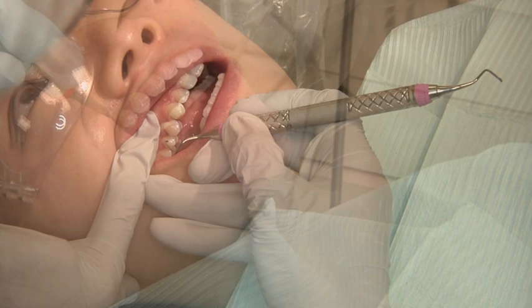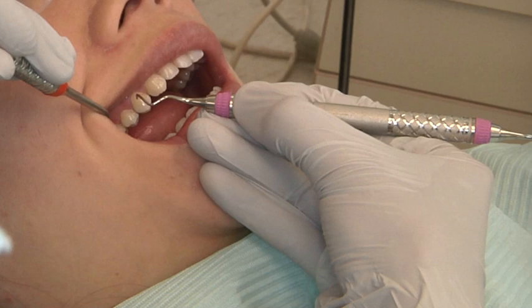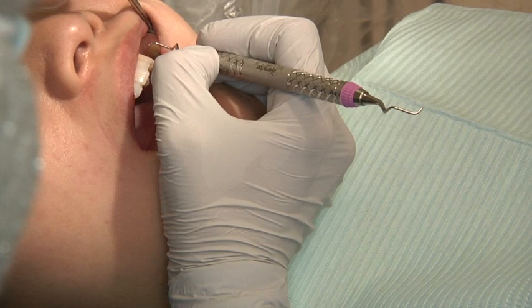palm facing out extraoral, where the front surfaces of the middle, ring, and pinky fingers are resting extraorally on the mandibular arch. Fingers should also remain straight and together while resting on the mandible. Chin cup extraoral, where the clinician uses his or her palm to cup the chin and mandible during instrumentation.